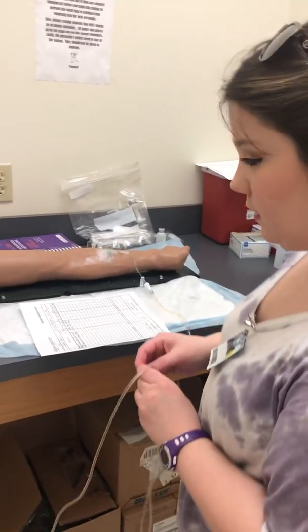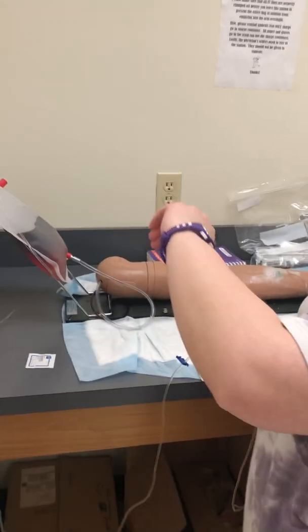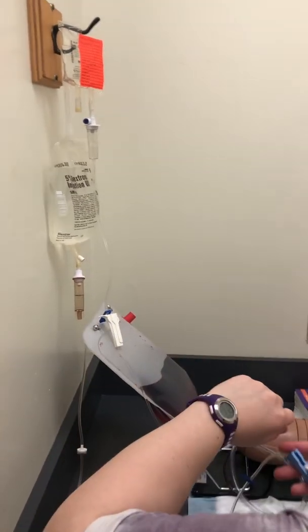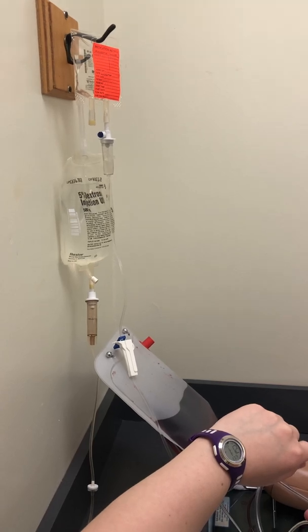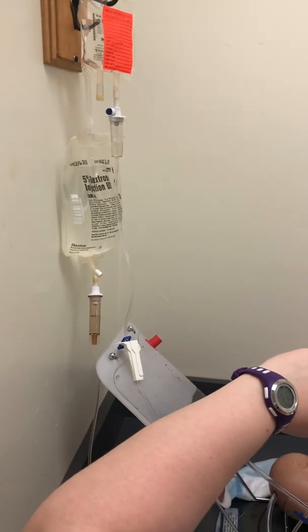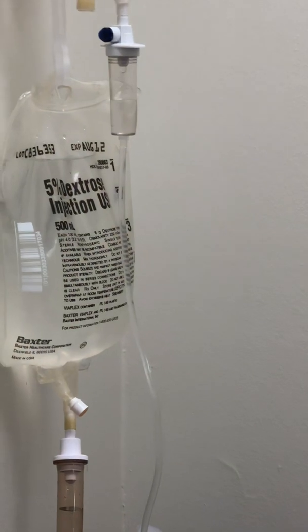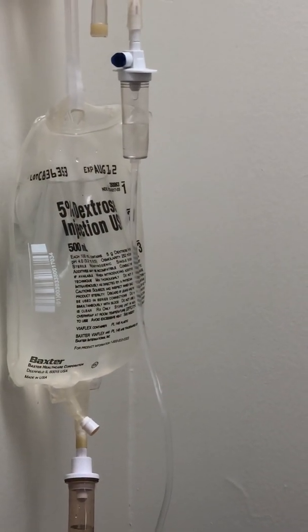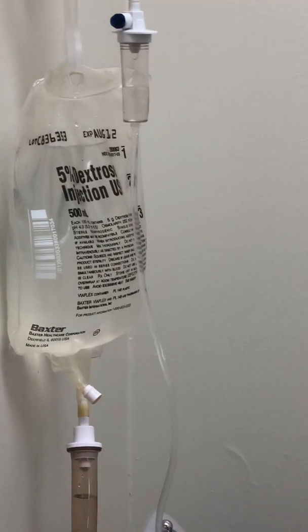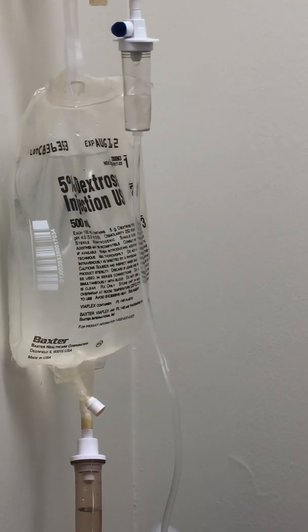Now that I've done all my safety measures, I'm going to start counting my drops, which is 8 drops per minute, which means I'm going to get 2 drops in 15 seconds. Okay.